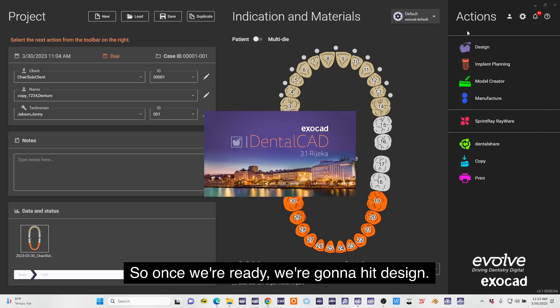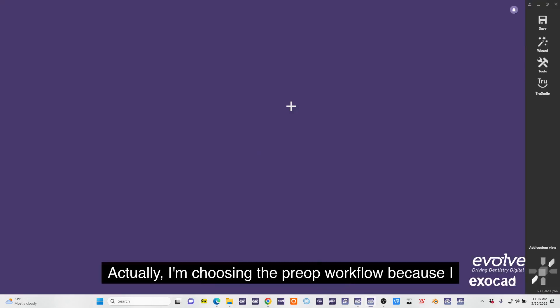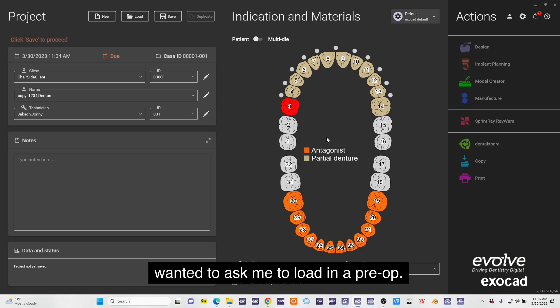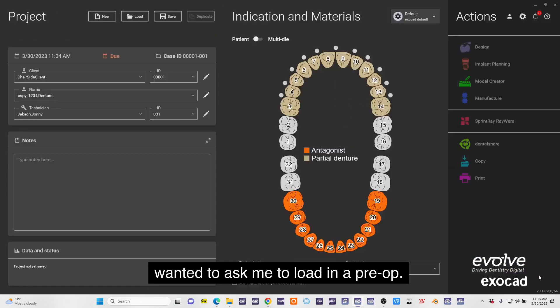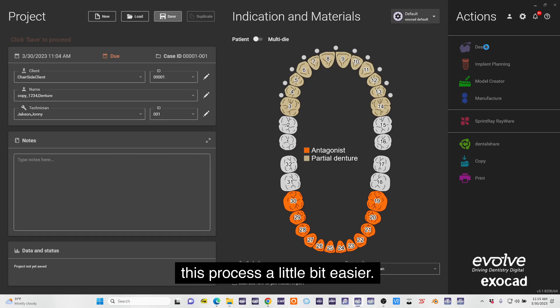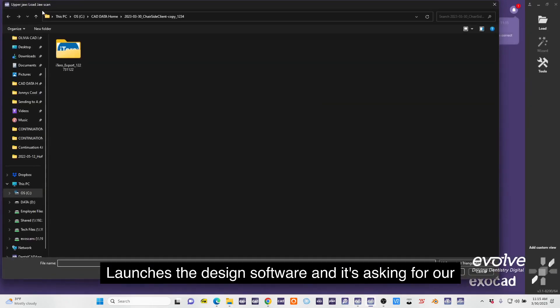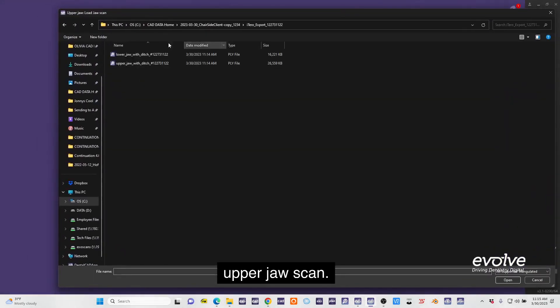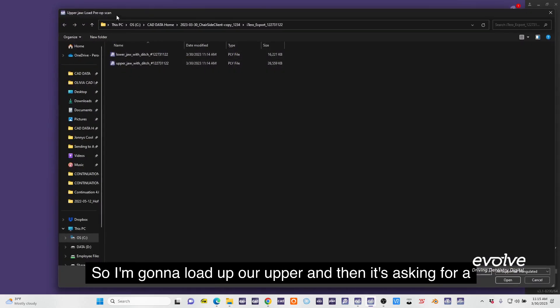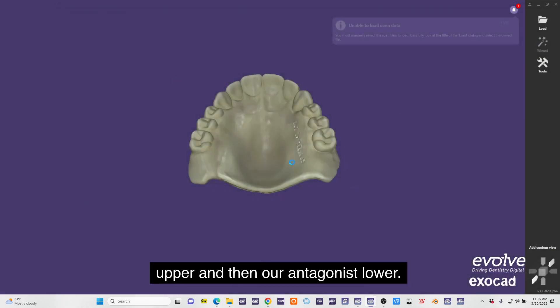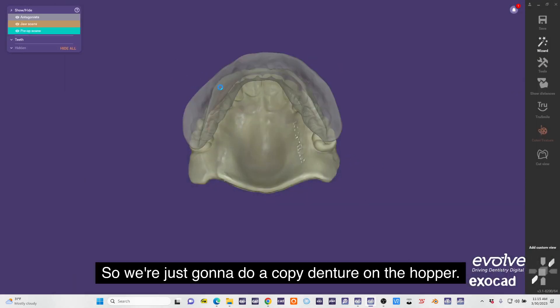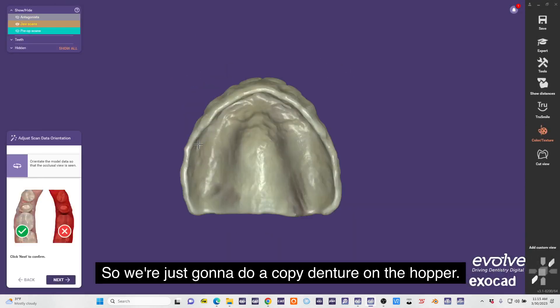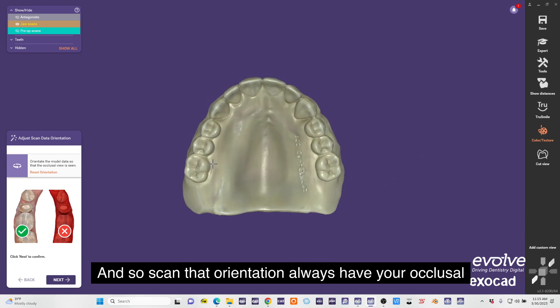Once we're ready we're going to hit design. Oh, I want the pre-op model on there actually. I'm choosing the pre-op workflow because I wanted to ask me to load in a pre-op - that's one thing I messed up, makes this process a little bit easier. It launches the design software and it's asking for our upper jaw scan, so I'm going to load up our upper. Then it's asking for our pre-op which is also our upper, and then our antagonist lower. We're just going to do a copy denture on the upper.